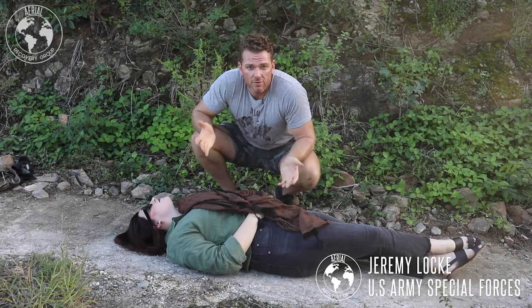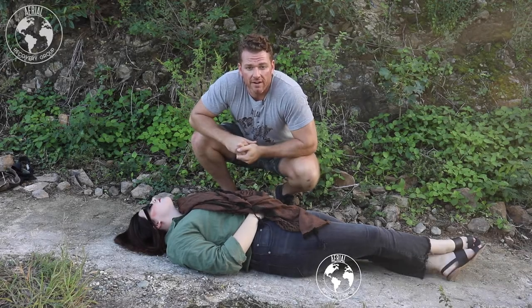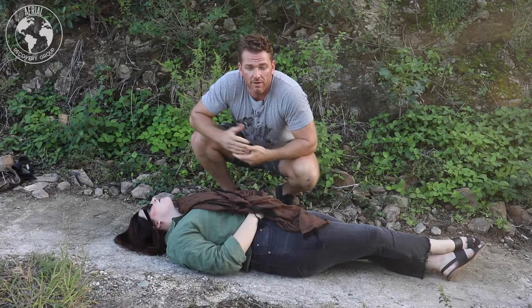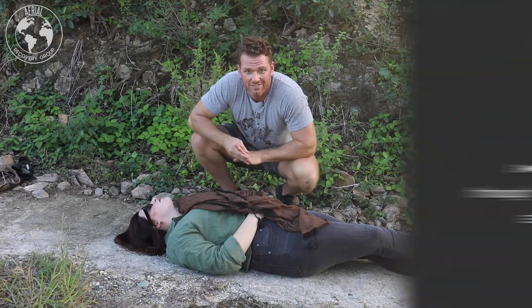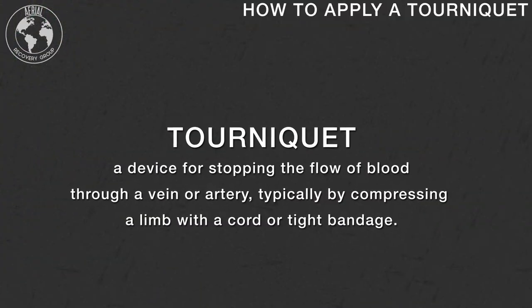I'm Jeremy Locke, a U.S. Special Forces Green Beret. You should recognize me from some of the other videos we've been doing working with Aerial Recovery Group. I'm out here in the Caribbean and I'm going to teach you how to apply a quick and hasty field tourniquet, as most of you probably aren't walking around with tourniquets.